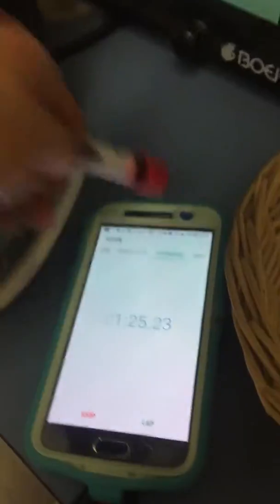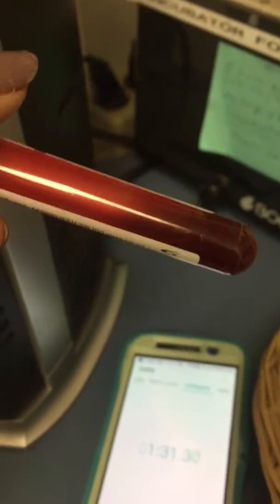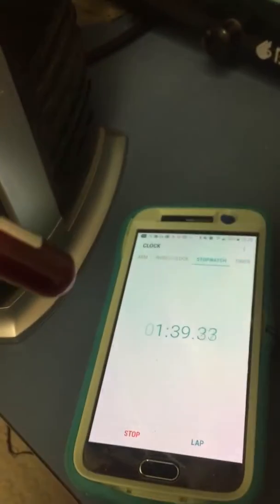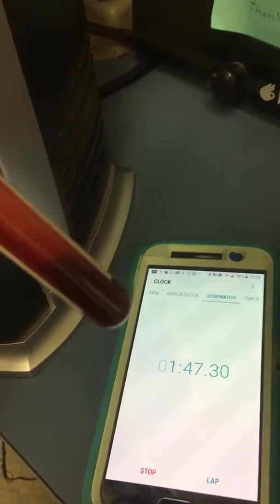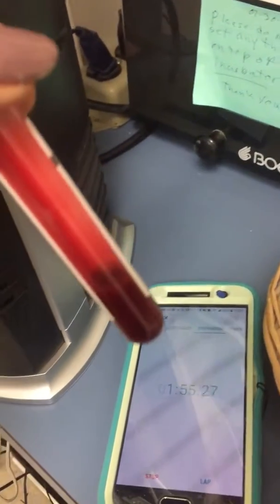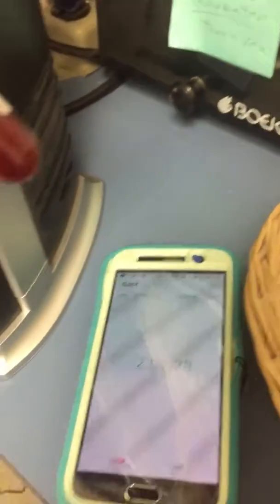It really doesn't need to be going back in and out since my hand temperature is the same as 98.6, as it's supposed to be. Five more seconds. Five seconds.